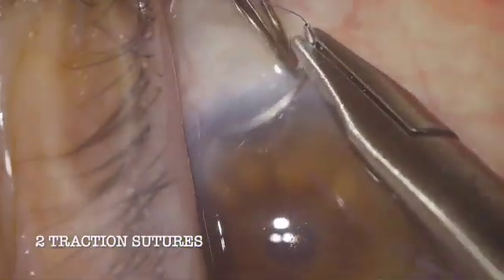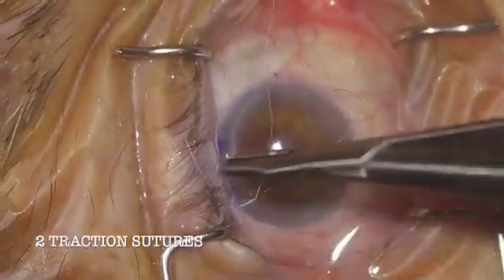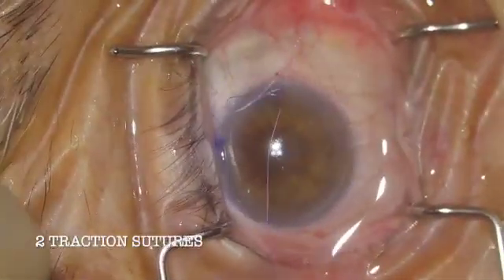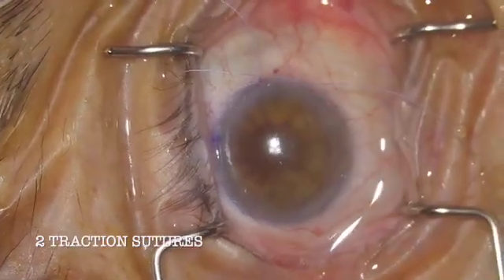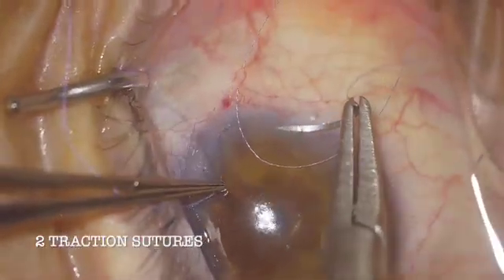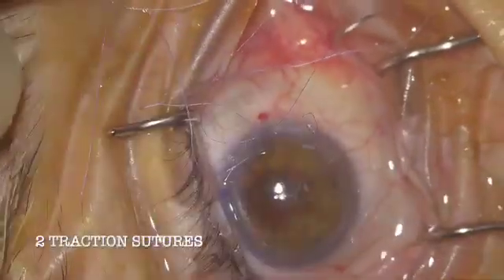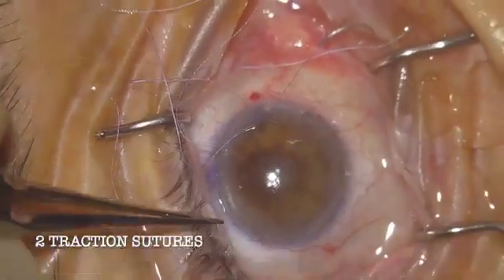Today I want to show my favorite approach for thin conjunctiva glaucoma surgery with an ab interno Xen. I really like this approach because patients on chemotherapy, patients on different kinds of immunosuppressants, people with thin conjunctiva, and more senior patients — these patients' glaucoma surgery sometimes gives a little more concern with suturing.